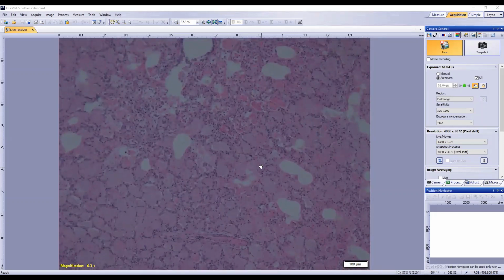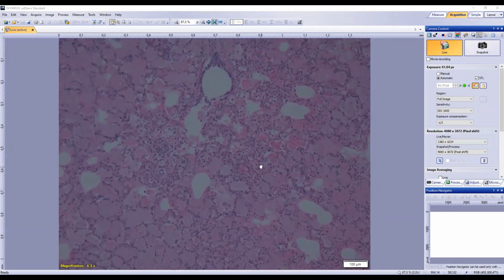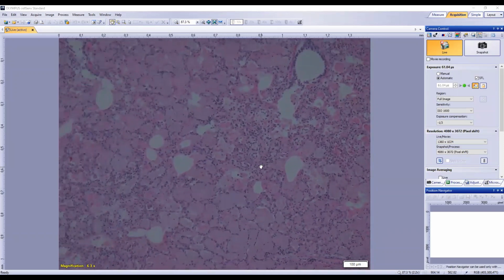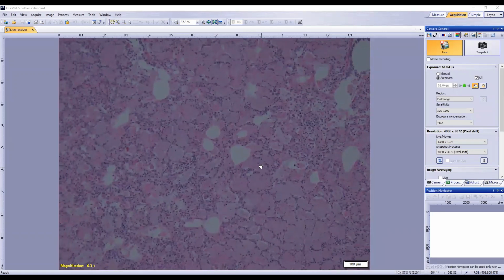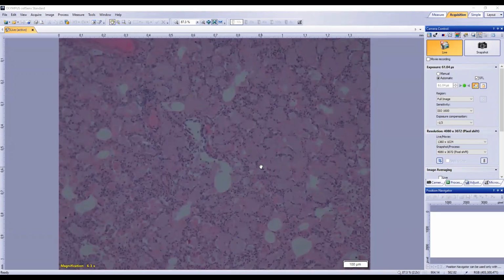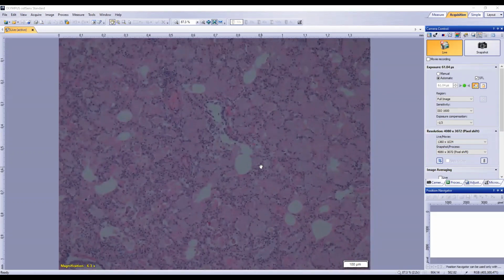Gram-negative. Rhodococcus is a good thought. Would we see a Rhodococcus lung looking like this? This would be more focal, multifocal, pyogranulomatous. Yeah, typically, yep. Actinobacillus, Klebsiella, yep, those are really good. Strep equi, yep, that's one of the ones we'd want to rule out.